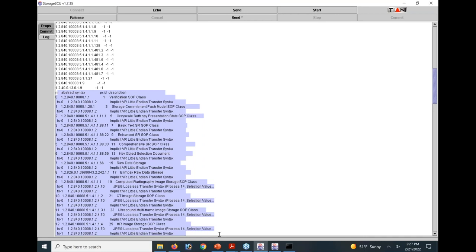So this happens every single time there's a DICOM communication, whether you're doing an echo, sending an image, or pulling a worklist. After PDU 1 and 2 have established that handshake, it's wide open. It's not like, here's an image, and they're stuck to that image, nothing else. They're configured to do everything every single time.